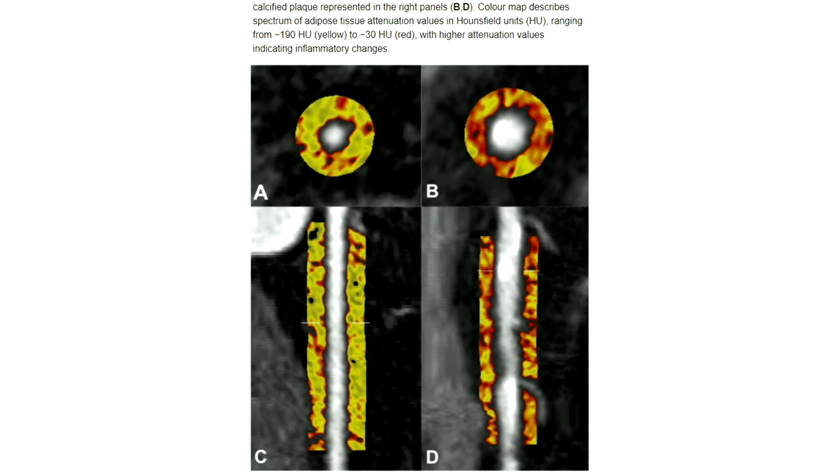And that is where there is significant inflammation. And these are the pictures that you see. I think this is a difficult one to work with, right? Because we're very used to looking at the focal local stenosis, and now we have to think differently. So this is not a target for whatever intervention. We're not going to do PCIs on these patients.